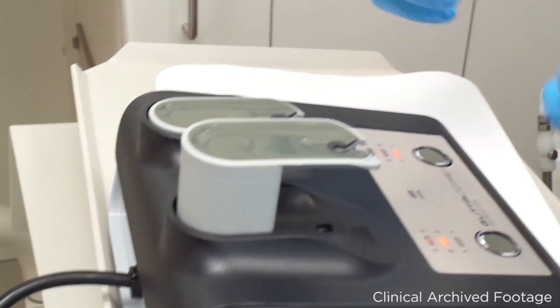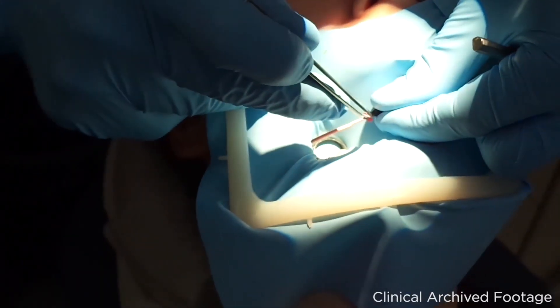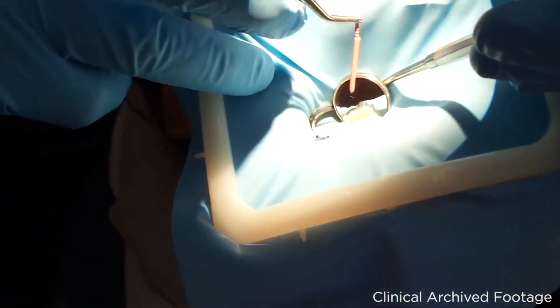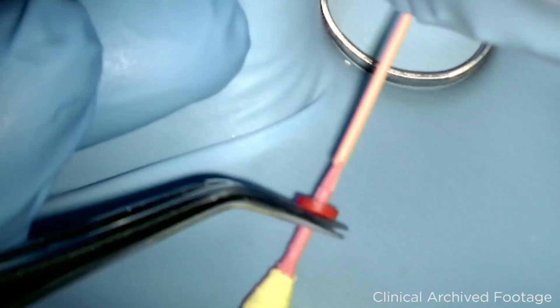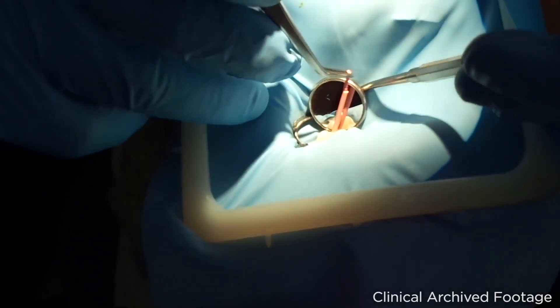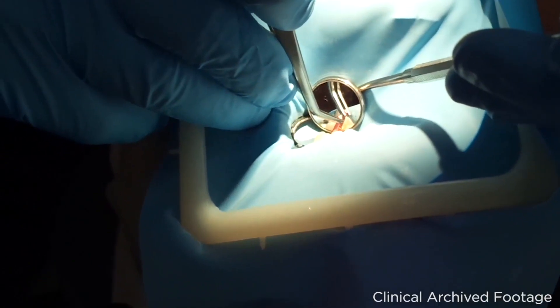My third tip is regarding transportation and insertion of the GuttaCore obturator. Try picking the GuttaCore obturator above the rubber stopper with self-locking cotton pliers. If extra space is needed, like when obturating the mesial canal of a lower molar, remove the handle above the pliers. This technique will give you more control and precision when placing GuttaCore in the root canal, especially in canals that are harder to reach.